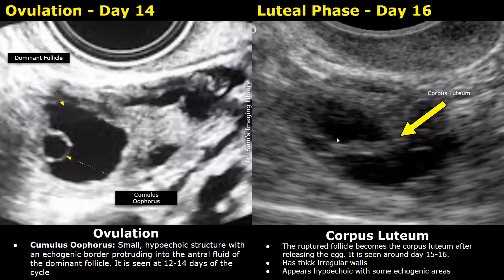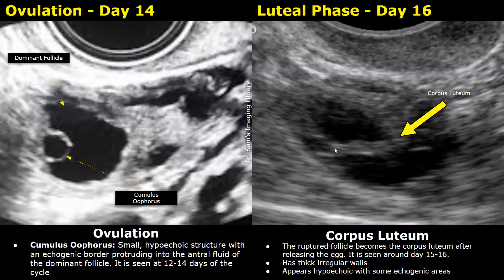The image on the right is taken on day sixteen, which is the luteal phase — ovulation has already occurred. The follicle has ruptured to release the egg prior to day sixteen. What we see here is the corpus luteum. The dominant follicle ruptures to release the egg and then becomes the corpus luteum. The corpus luteum has thick, echogenic, irregular walls. The appearance of the corpus luteum is a sonographic sign that ovulation has already occurred.